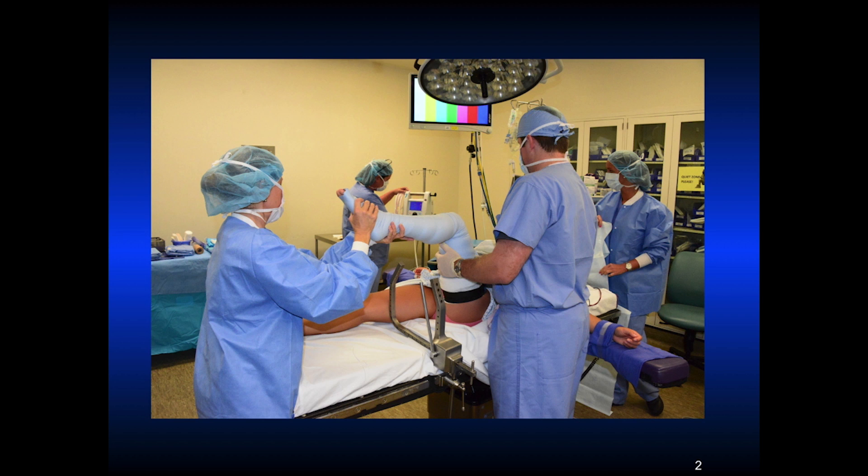This is done under a general LMA anesthesia. The tourniquet is applied as high on the upper thigh as possible. I use a Lanny Johnson leg holder, positioned just above the break of the table, with the patient down far enough. I exsanguinate the limb and put the tourniquet on before we put the leg holder on, because the leg holder acts as a tourniquet. The scrub tech is elevating the tourniquet and there's plenty of room to do the procedure.